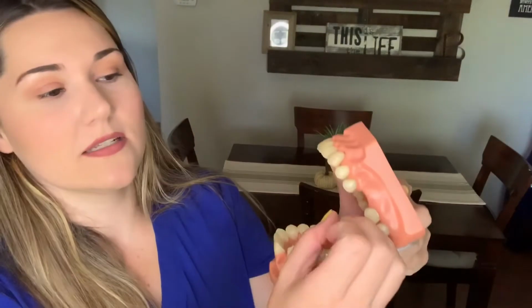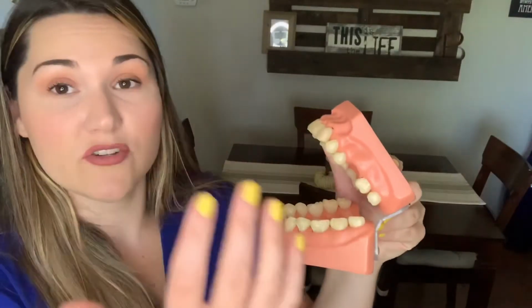And then you're gonna irrigate the socket. So you're gonna have a larger syringe that's gonna have chlorhexidine in it, which is a bacterial mouthwash, or sometimes they'll rinse with distilled water. But you'll inject that into here, so you'll get your suction and you'll hand that to the dentist and he'll inject that and you'll put your suction up here to suck it out so the patient doesn't swallow it. And it'll just rinse out the blood and everything that might be left over, any infection, things like that.